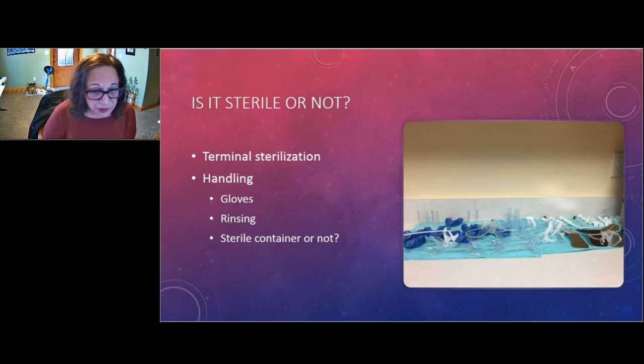and move on. Because once you take something out of that soak container, it could become contaminated again, especially look at how you're storing it. If you store it in a dirty drawer, now it's no better off than when you took it out of the patient's mouth, truly. Yeah, great point. Next question.